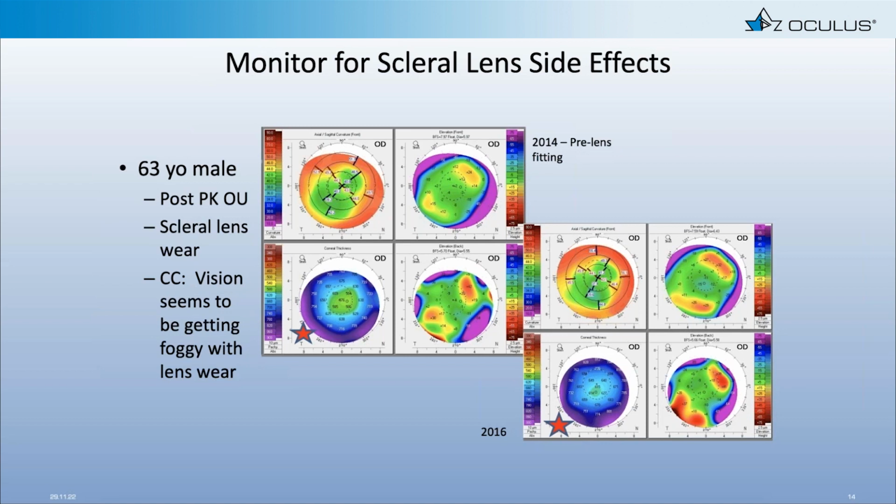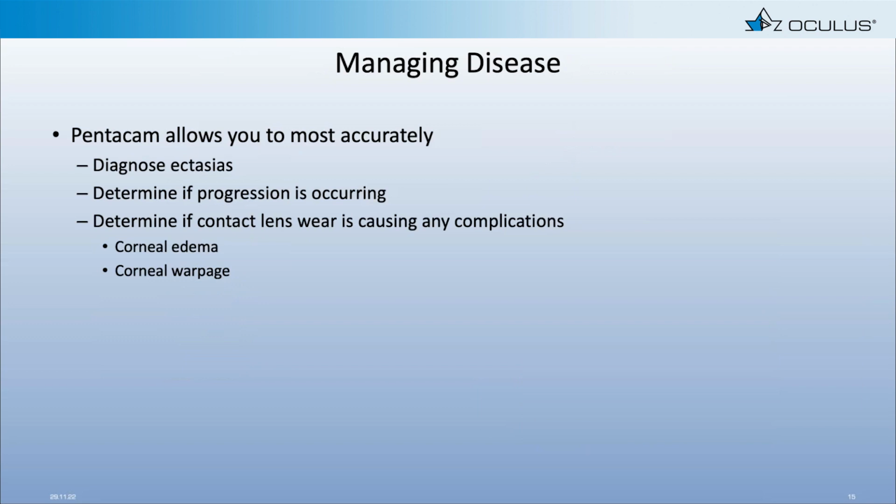And ultimately, this patient was referred back to cornea for a DMEK procedure over his graft and was then able to be refitted back into scleral lenses after that procedure was done. So again, just helping us to differentially diagnose properly when patients may be having symptoms that we think might be related to our contact lenses, whether it's warpage of the cornea, whether it's edema, et cetera.